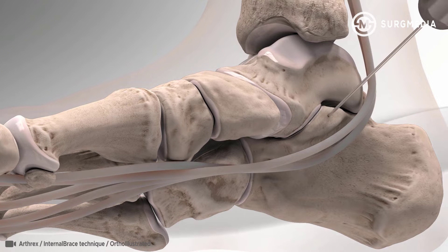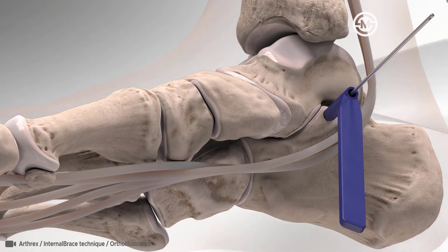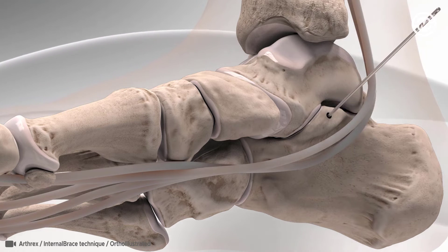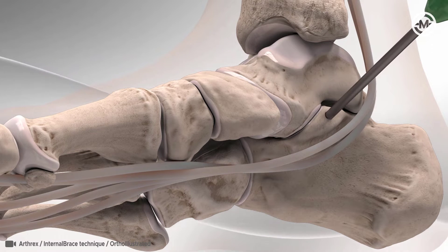Next, the surgeon will create a bone tunnel by drilling into the sustentaculum tali of the calcaneus using a guide wire and drill guide. The bone tunnel is made in the calcaneus to prepare for a swivel lock suture anchor loaded with fiber tape.